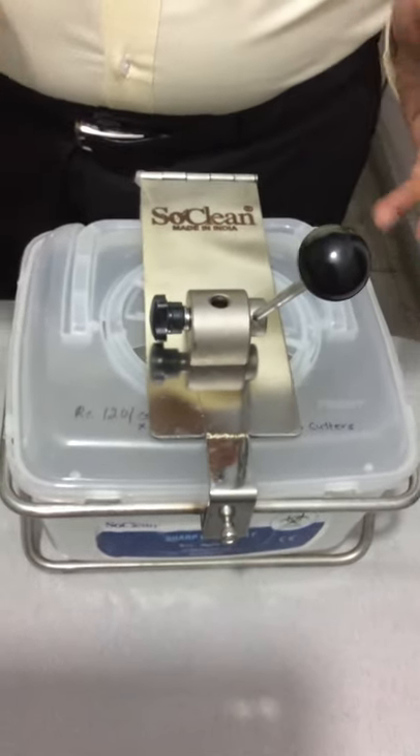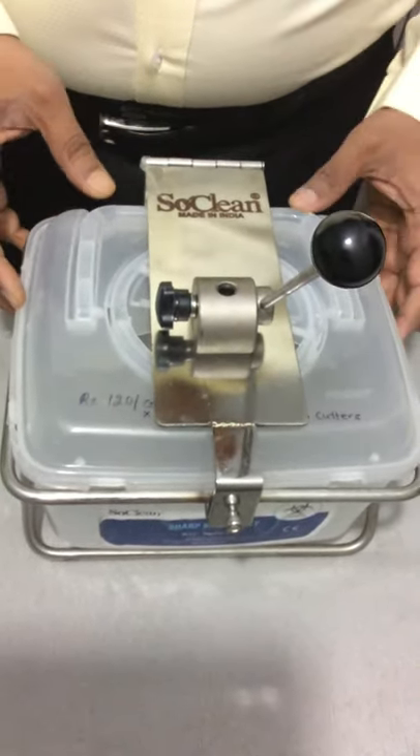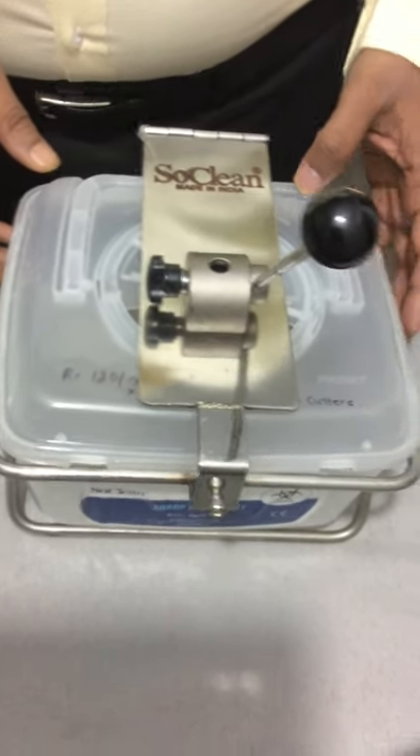Still, because during use the syringes and needles get contaminated, it is very important to introduce the next step — how to dispose of these contaminated syringes and needles. As per the new guidelines, it is very important to have a robust needle and hub cutter. PJI has innovated and designed this type of needle cutter and hub cutter.